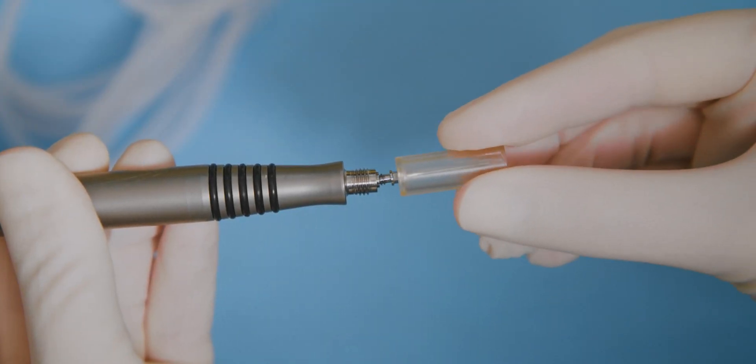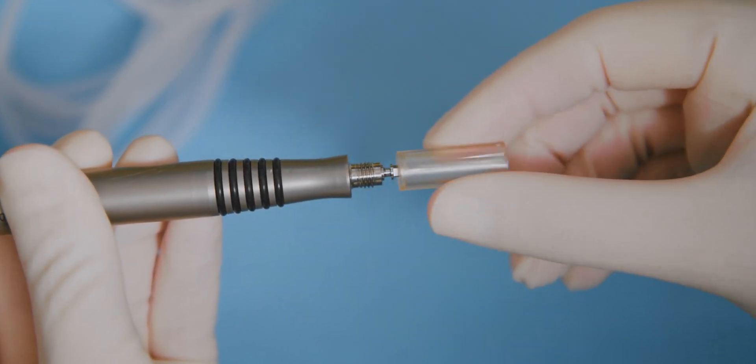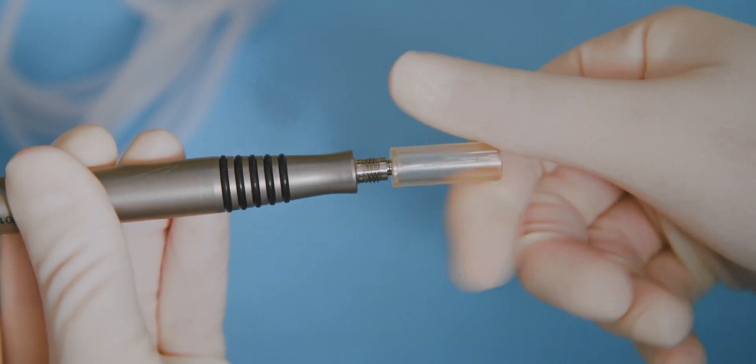Connect the easy phaco tip to the handpiece. Turn the tip gently in a clockwise direction until it locks into position.